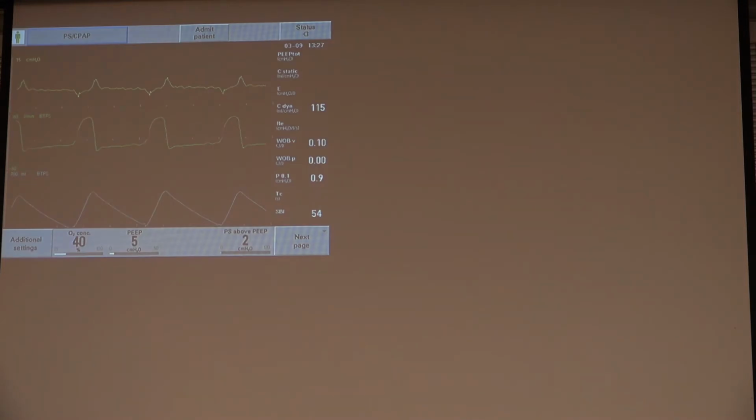Sorry. All right, changing modes, pressure support ventilation. What sort of things do you see looking at this person's pressure tracing and flow tracing? This doesn't look like pressure support, really. This doesn't look like very good pressure support, right? Looks like really bad pressure support.